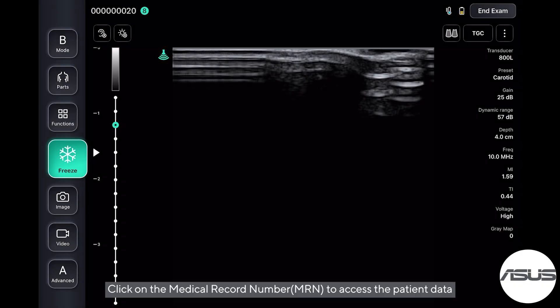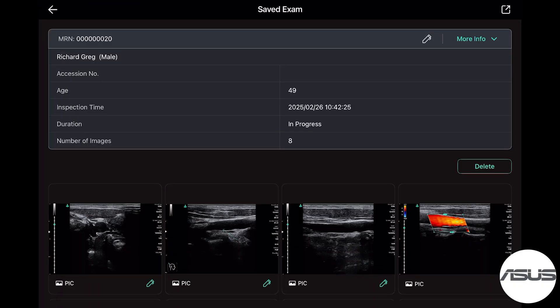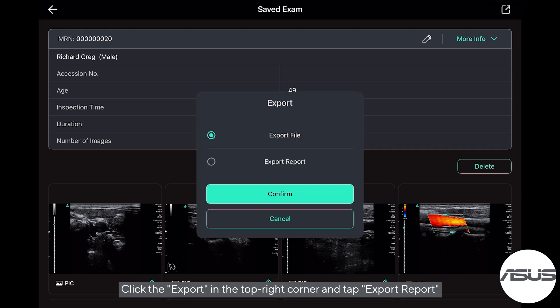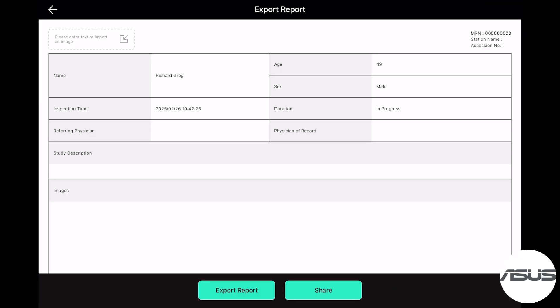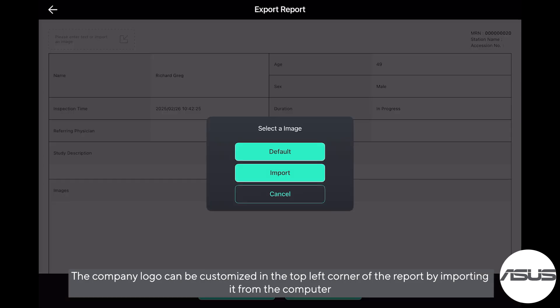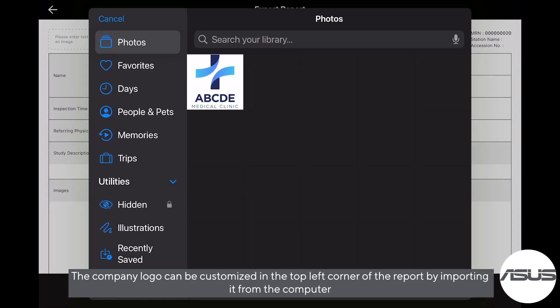Click on the Medical Record Number (MRN) to access the patient data. Click the Export button in the top right corner and tap Export Report. The company logo can be customized in the top left corner of the report by importing it from the computer.